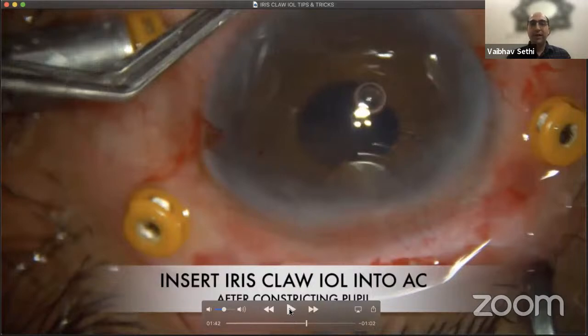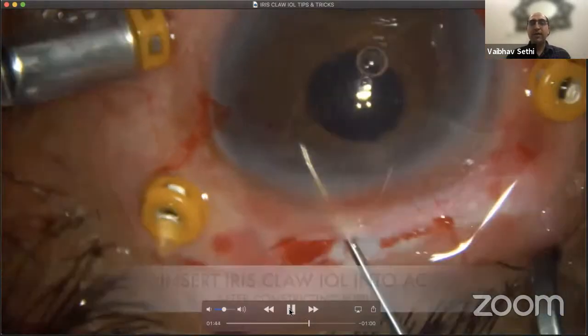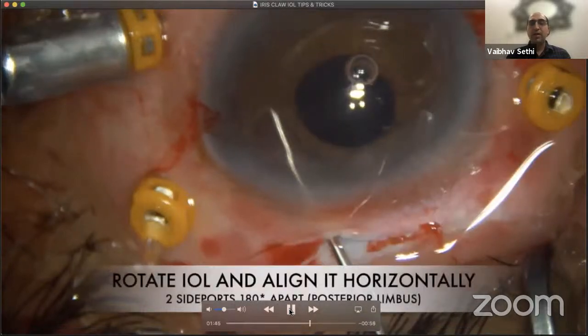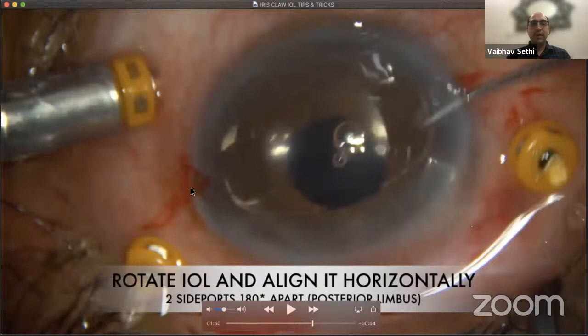Once you've done that, your AC is well formed, because you're going to do anterior chamber maneuvers. Preferably place valve cannulas, because it will be easy for you to maintain your IOP. I've already made my two side ports 180 degrees apart at 3 and 9 o'clock. You can make it accordingly. It's always better to go slightly posterior limbal, as I'll tell you why: it helps you to enclavate better, and your visualization while enclavating is better.